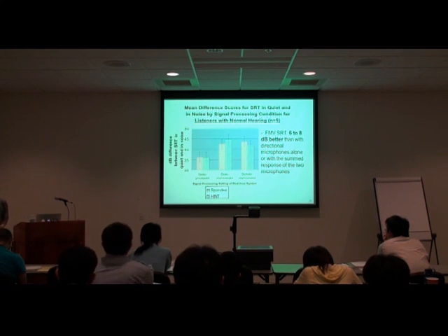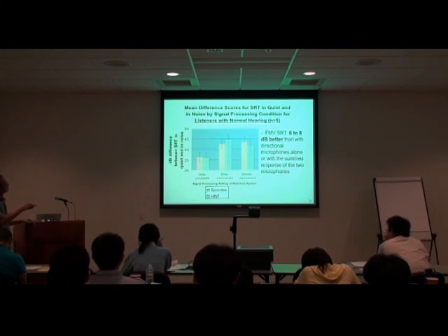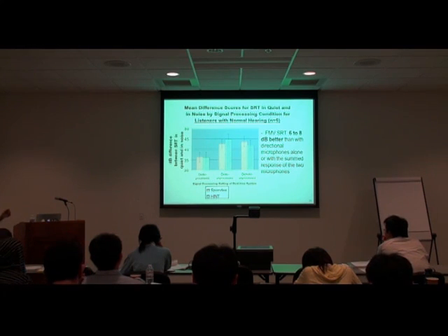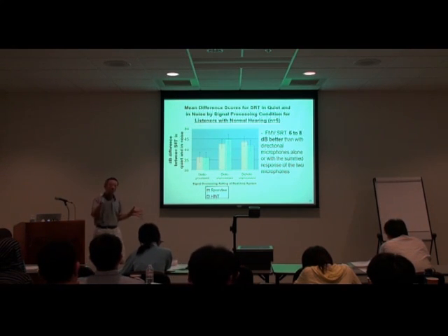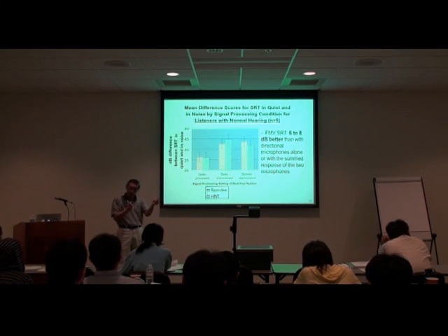Now, not only people who are hard of hearing are being helped, but you and I are also being helped. This is also interesting for people with normal hearing, that we can see there is significant gain for us. And when we do the demo, we put the microphones on the corners of the eyeglasses. We have people in the room all talk at the same time. There could be 8, 10 people or more. And the fact is you can steer the device and pick up the signal.